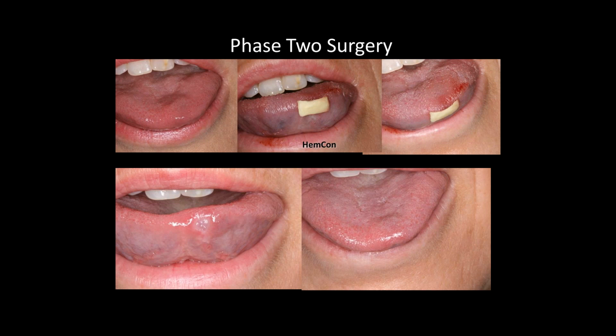So just like with this case, two steps, completely got rid of a large hemangioma. That patient really didn't have another option. So lasers are pretty cool.